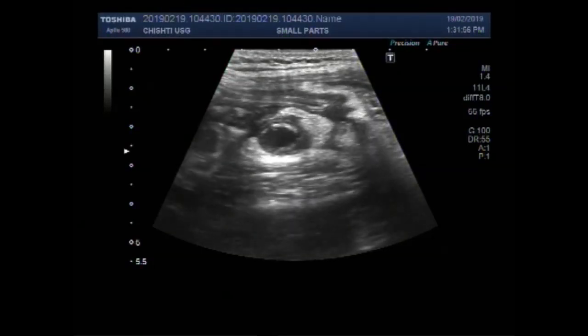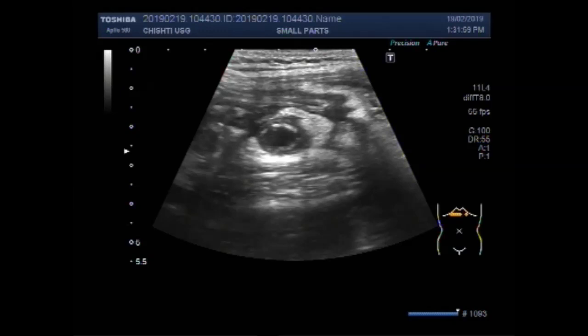Dear viewers, I hope you are all fine. This ultrasound video shows focusing of the acute appendicitis.